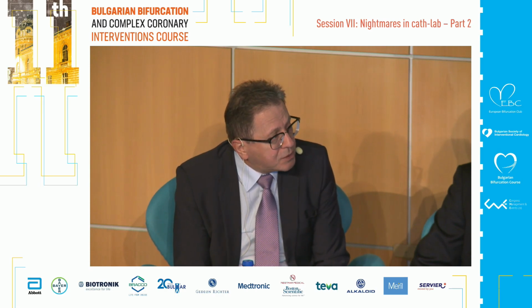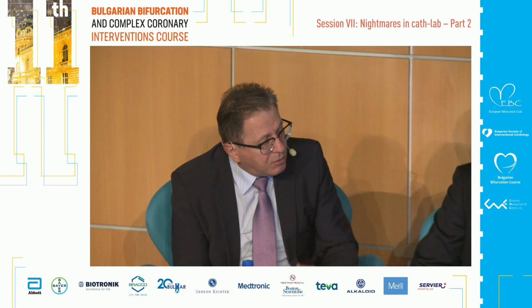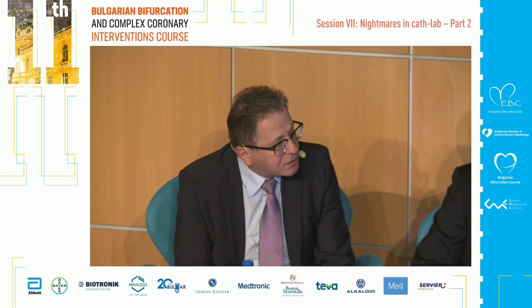We used to prepare patients for full or complete revascularization before the procedure. Right now, if we have asymptomatic patients, we have a very big improvement in the performance of the patient after TAVI. In the majority of cases, there's no need to touch these arteries because the patients are very old.